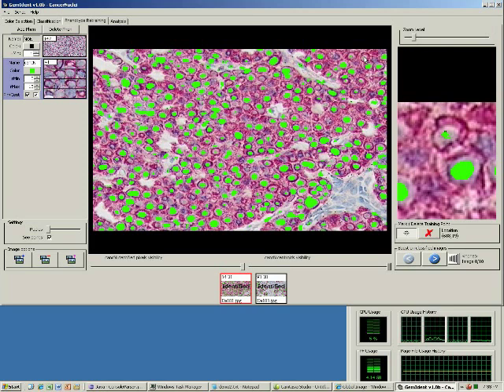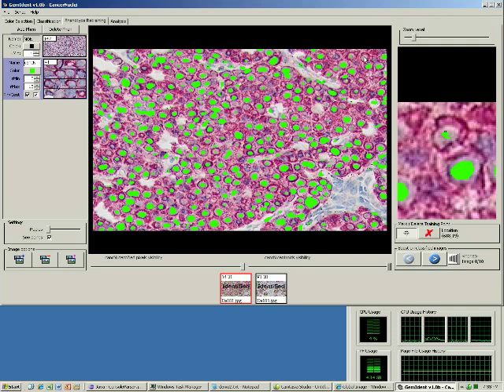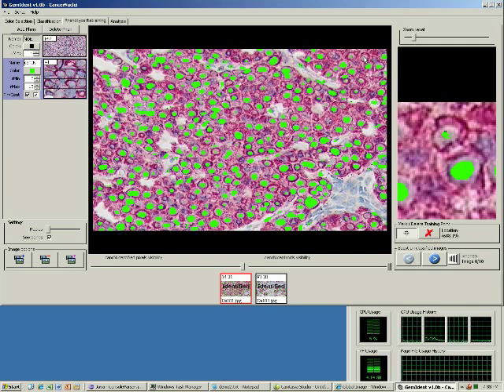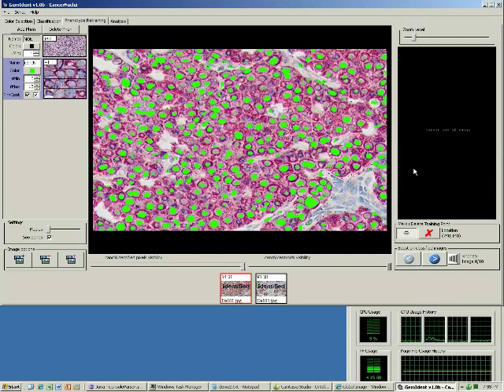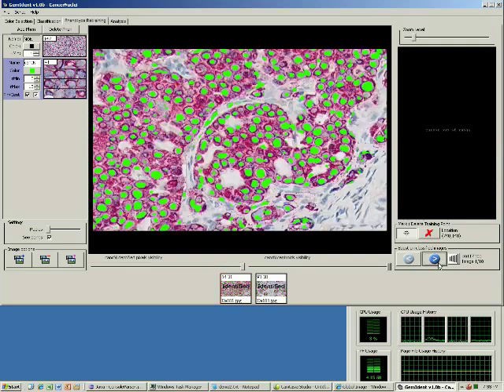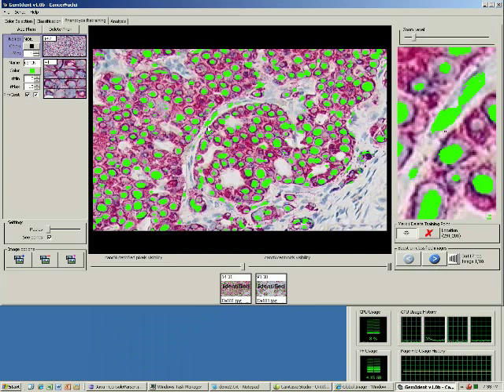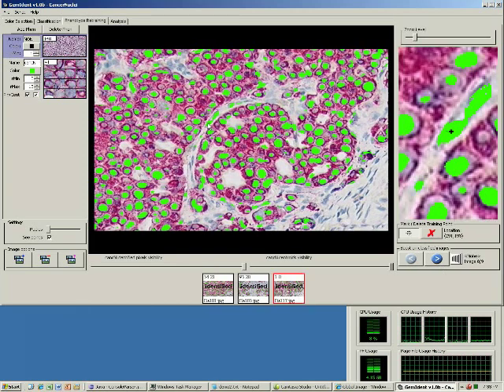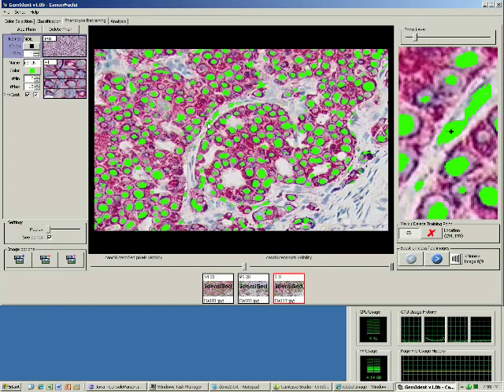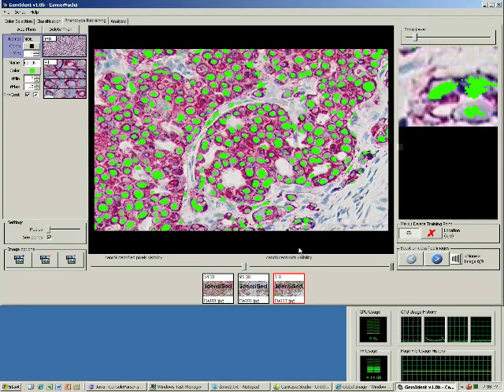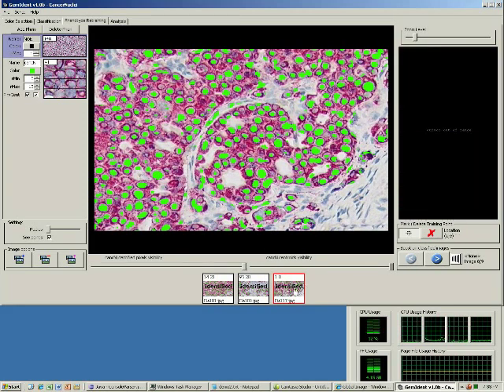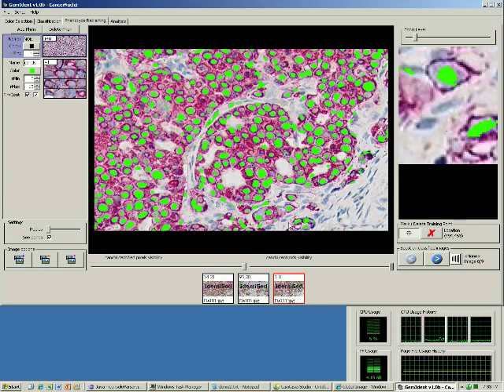Now we will boost the training set by looking over those ten random images. Locating Mistaken Training will automatically add the image to the training set. See how the image popped up down here on the thumbnail pane? Let's go through them correcting the errors.